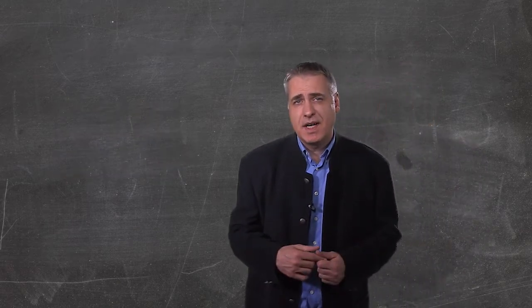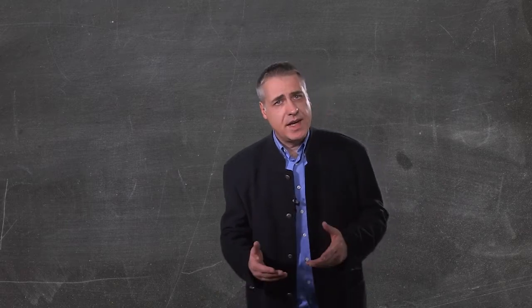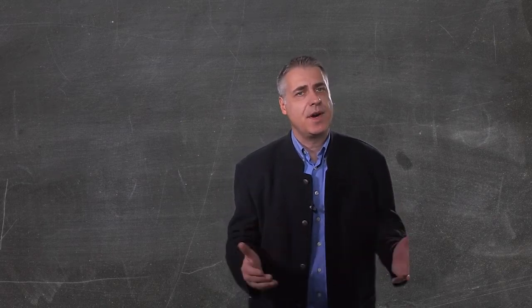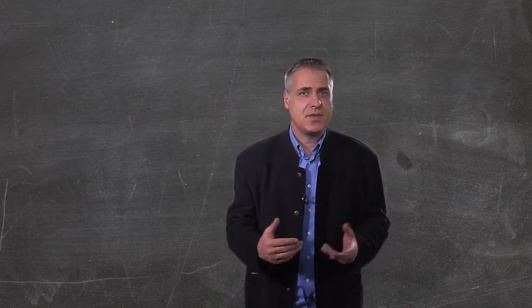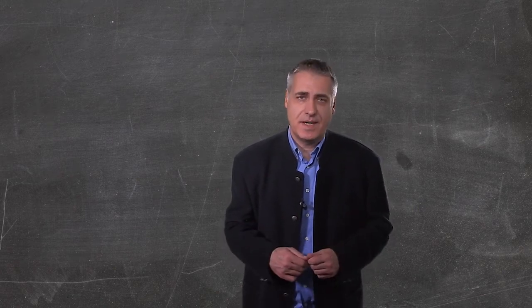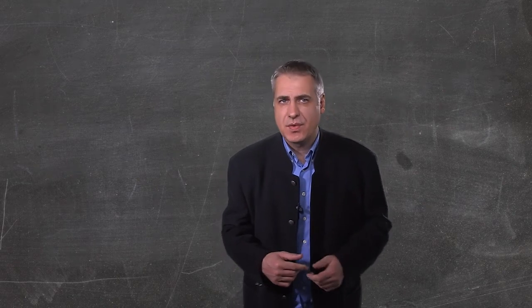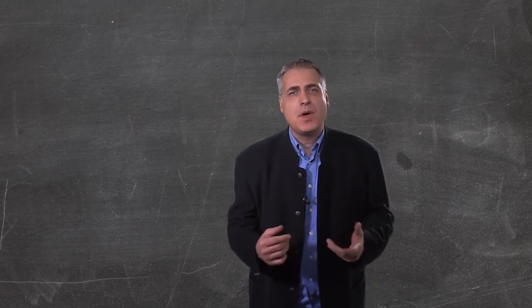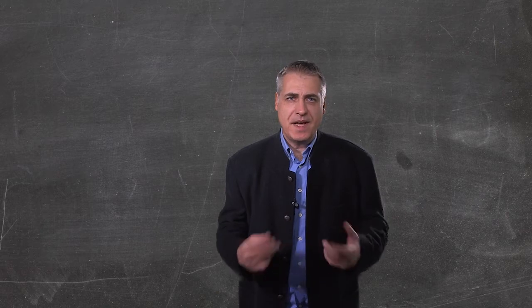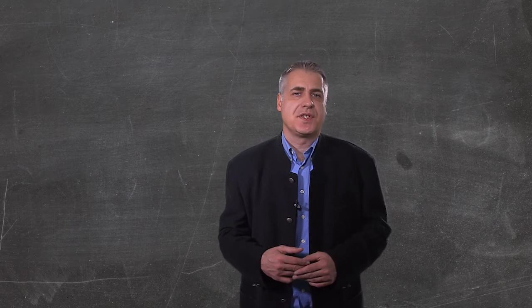So let me summarize the applications in endodontics. For post-removal, location of hidden entrances, removal of calcifications and fragment removal, magnetostrictive and piezoelectric systems are appropriate devices. For retrograde preparation and surgery, the piezoelectric systems are more suitable because of their back and forth movement. For passive ultrasonic irrigation, all systems are efficient.